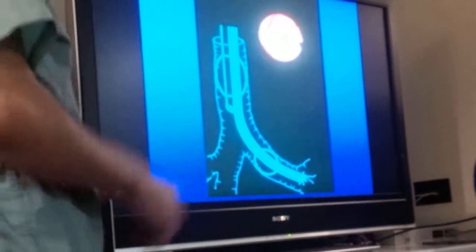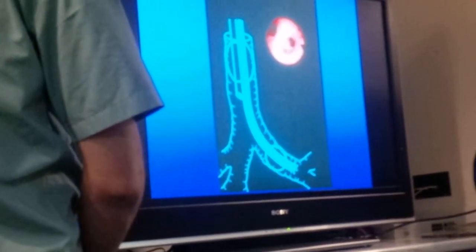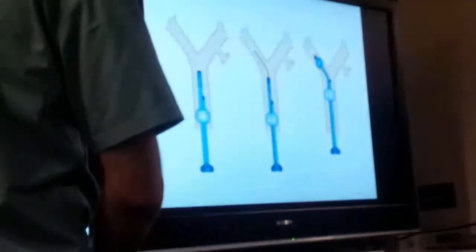And this is another picture. The bronchial lumen is pushed too deep, and sometimes it goes into the left lower lobe side, so the upper lobe will not be isolated. We saw a case like this last week with Koishan. Okay, so this is the proper position.